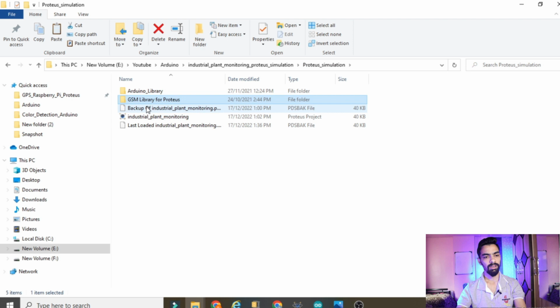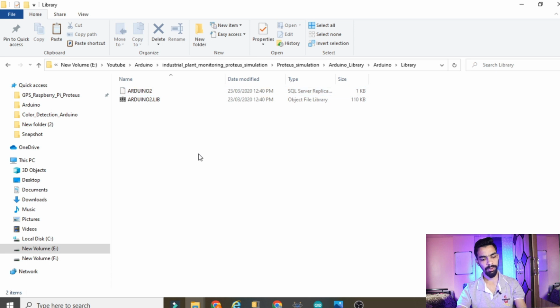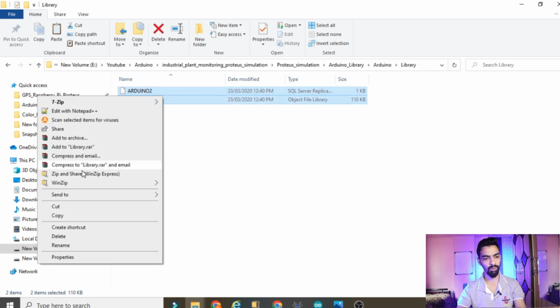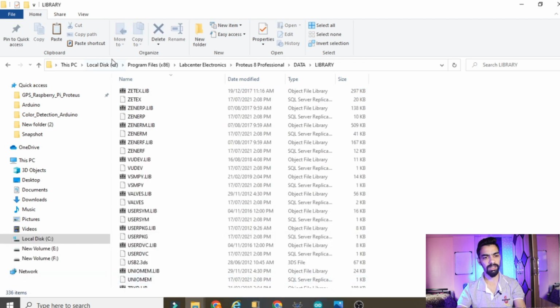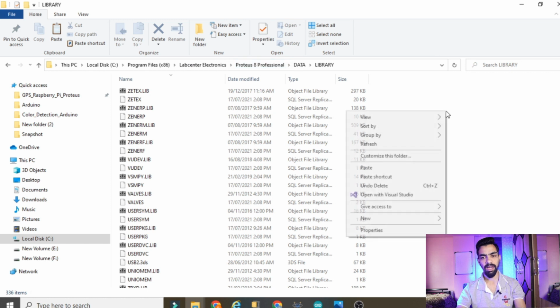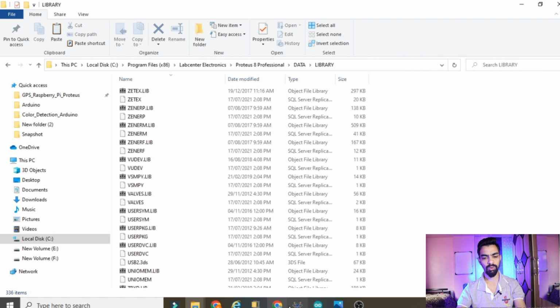You can see there is the Arduino library folder. Again go to that folder and you can see there is a library folder. Copy these two Arduino files, and again go to the same path, C drive, Proteus 8, Labcenter Electronics, Proteus 8 data library, and paste the Arduino library folder into this path. So it will install the Proteus library for the Arduino and GSM module on your laptop.